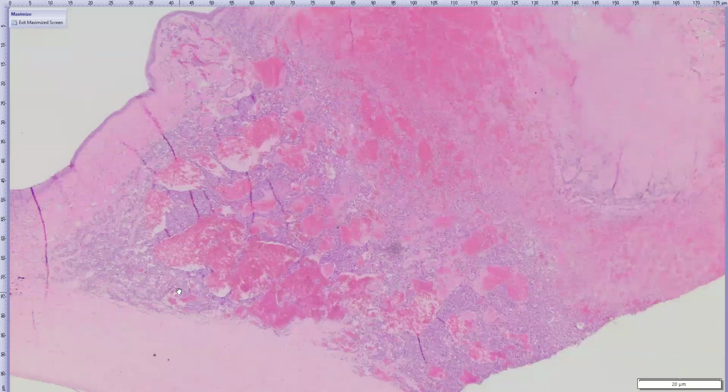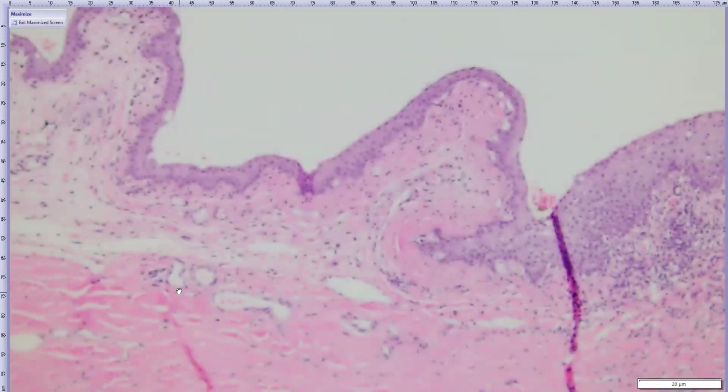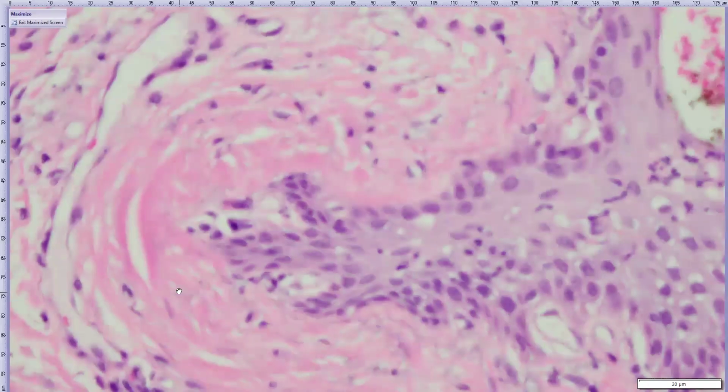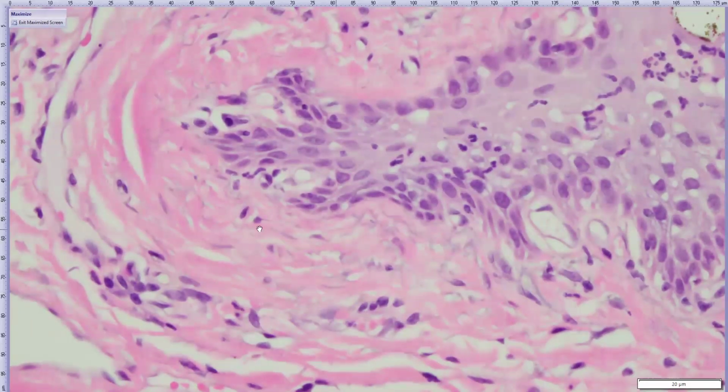So there's a couple of things that are of interest in this particular eye and worth discussing. One is that they say that this patient is outdoor only. So you'd imagine that this dog catches a good amount of sun. And at least in this extra section, so here's our tumor again, here's our cornea and our iris, if you drop in on the conjunctiva and you go in really close and you worry a lot, as is my wont, there are occasional serpiginous basophilic strands in the conjunctival substantia propria.